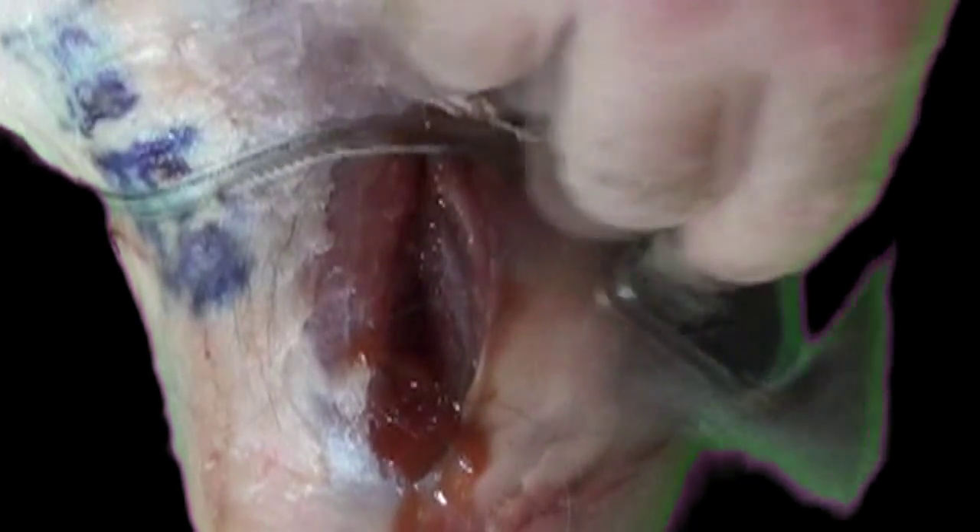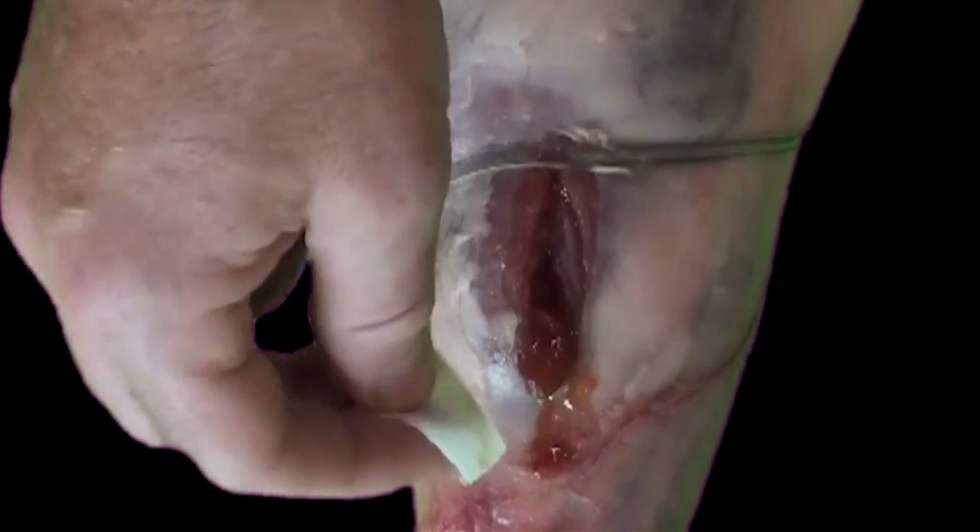Back tangles! Gross. And then irrigate the wound as you would normally. I then like to wipe off the skin with an alcohol prep both to remove excess moisture and also get any oils off the skin so that tissue adhesive adheres strongly.